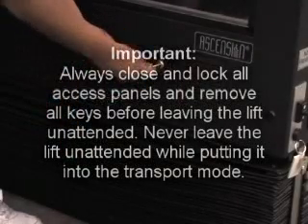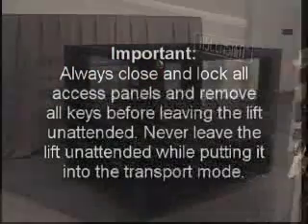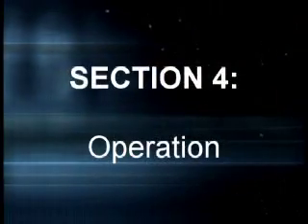Important: always close and lock all access panels and remove all keys before leaving the lift unattended. Never leave the lift unattended while placing it in transport mode. Push the lift at its lower landing end. As you push the lift, you will observe that the casters closest to you are able to swivel. Use these casters to steer the lift.